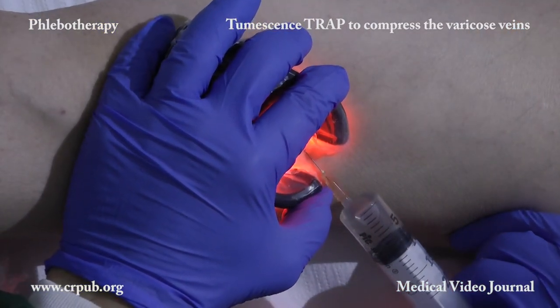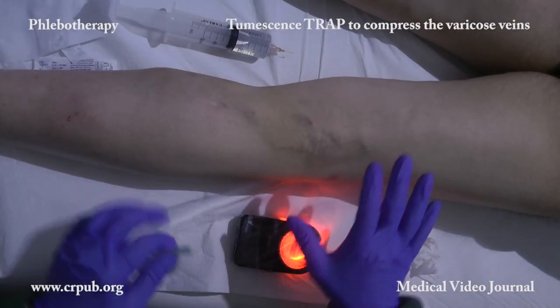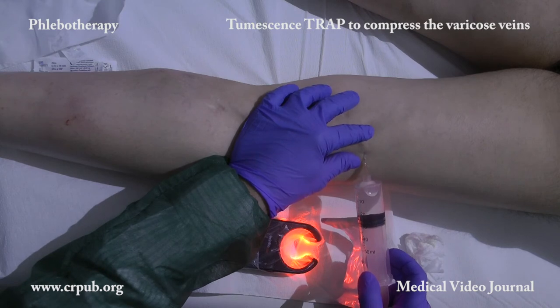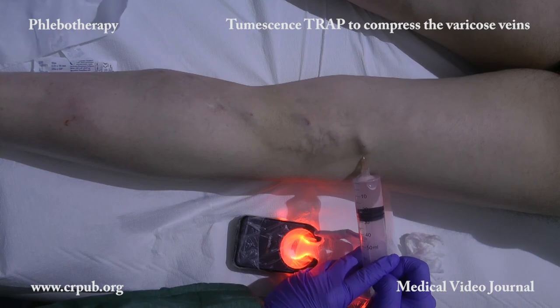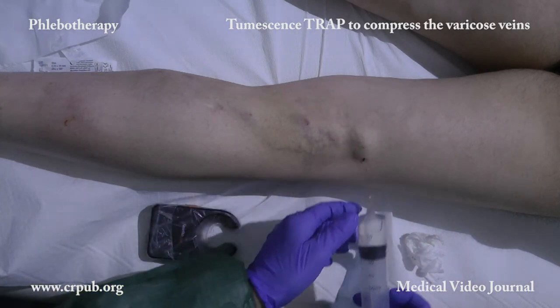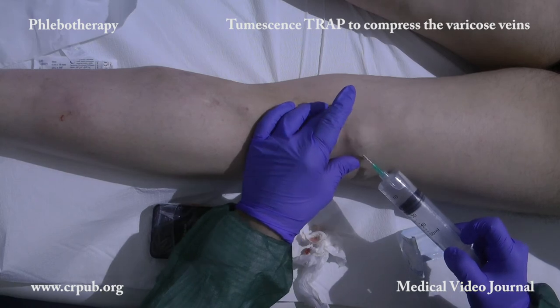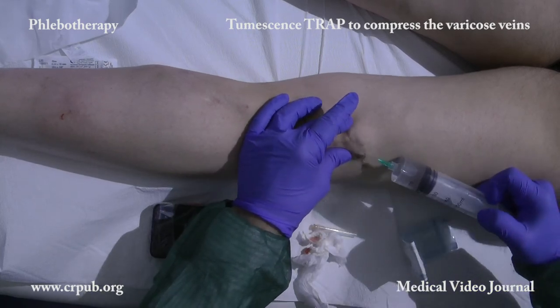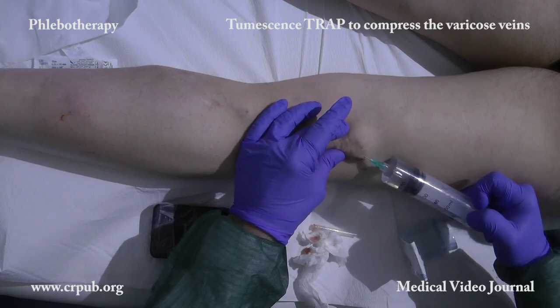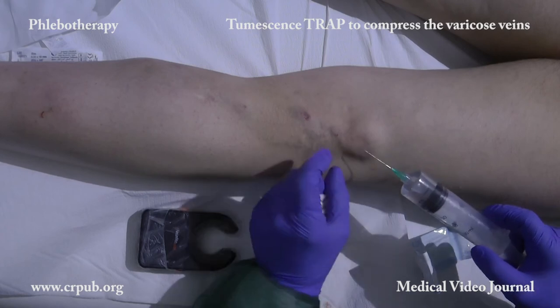Since the leg is a sort of pump, the veins must not be visible. A pump that cannot empty its collectors makes no sense. Once the three-dimensional injection of the regenerative solution has been completed, tumescence TRAP is carried out in the popliteal region, in order to compress the numerous ectatic vessels that have been injected. A syringe of a different calibre has been prepared before the session of phlebotherapy. This syringe contains 4ml of lidocaine and 20ml of glycerol solution with the addition of EDTA. After the first injection, we replace the 25g needle with a 21g needle, which enables us to inject more rapidly. Tumescence is created in the subcutaneous tissue above or below the veins that have been injected, in order to compress them.